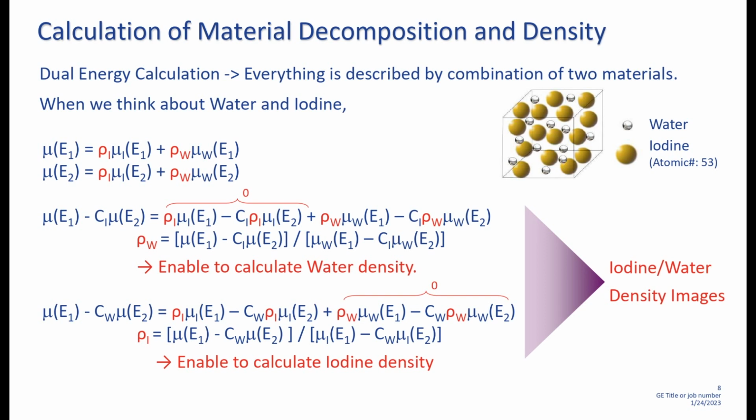Can we add lipiodol? Lipiodol, yes. Lipiodol is iodine. Partly iodine. The other component is a fat component, which has very low attenuation. So we can't differentiate lipiodol from iodine. We cannot. We will see it as a single material. The moment you want to suppress lipiodol, you can suppress iodine. But we need to differentiate, no? You cannot.